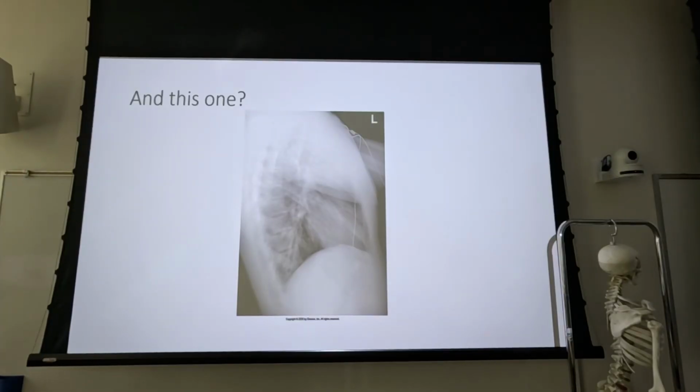and that needs to come with a little bit of integrity as well, meaning that you don't fall back on that on every exam that was just difficult, saying this was the best the patient could do. No, those are the outliers. That's maybe 10% of what you actually shoot. You should be able to get 9 out of 10 patients to cooperate better than that.